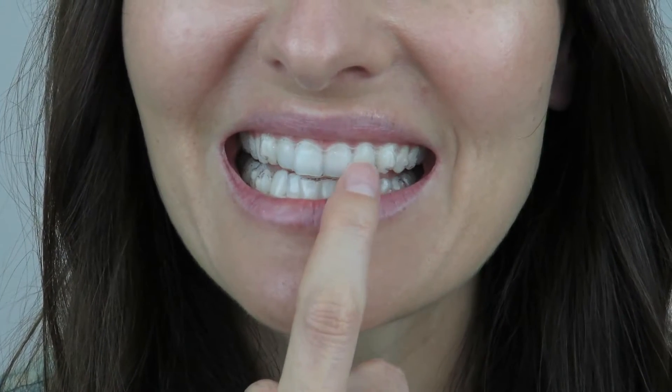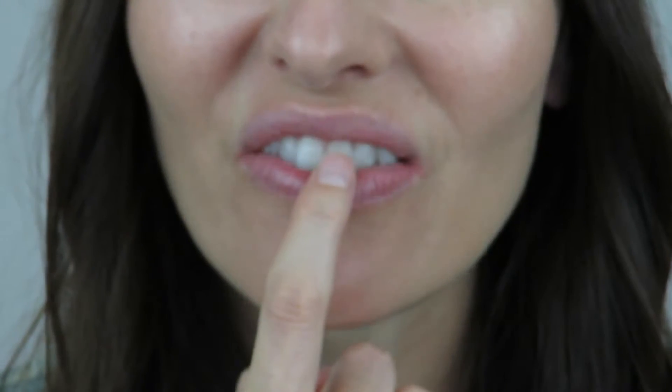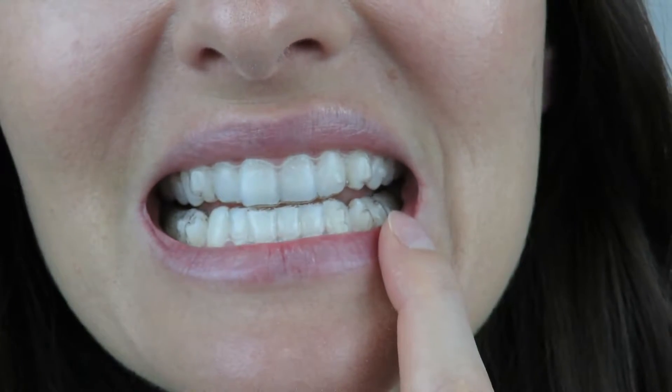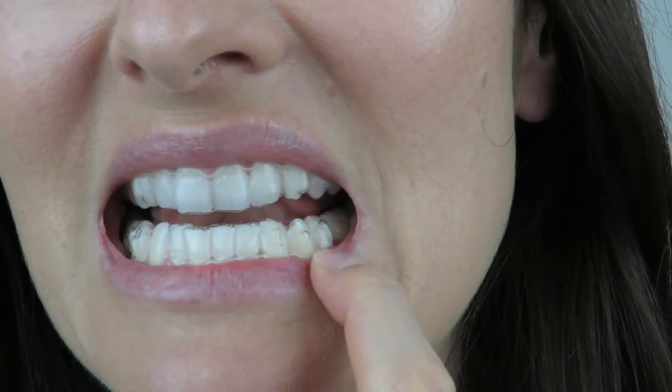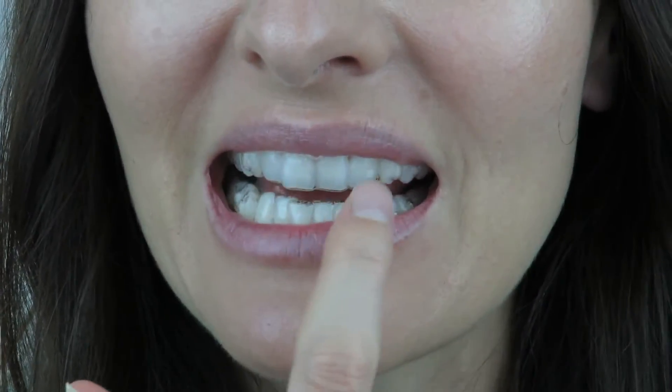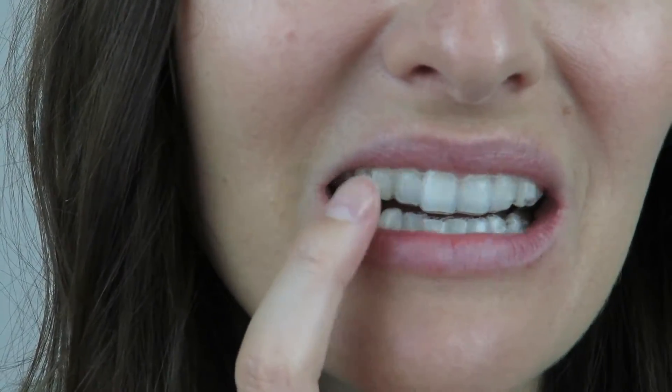This is what my Invisalign looks like. The ones at the front are not really that noticeable because they don't have attachments, but I do have a little attachment there. I've got a couple down here that will help pull these bottom teeth out, and a couple here as well. I don't have too many attachments — some people do need them on every tooth depending on how bad your teeth are. When you take the trays off they're even less noticeable because they don't have that bulgy bit on there, so it's not really that noticeable.